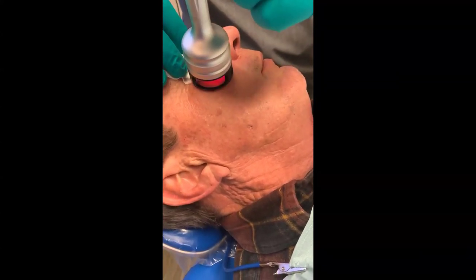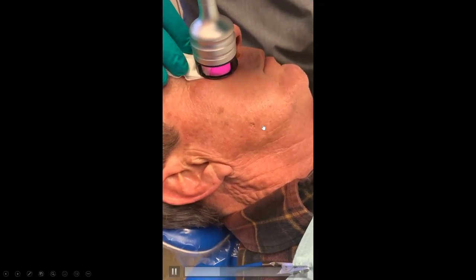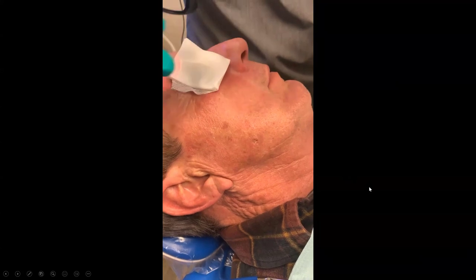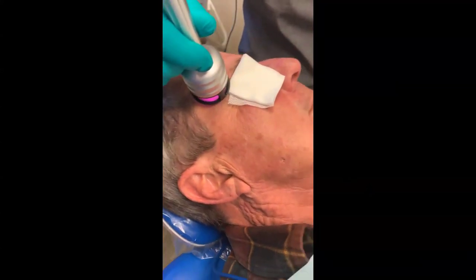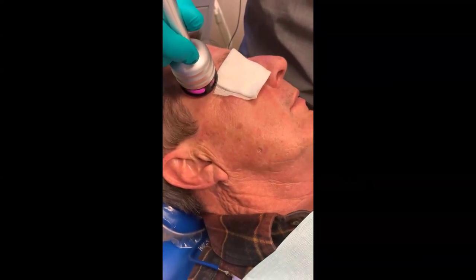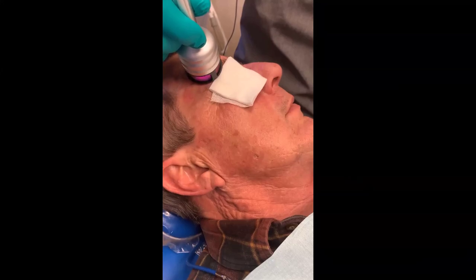But at one point, when we were up there, we saw his face twitch somewhere down here. This is the first appointment, and I knew I was able to help him. I got some excitation of the nerve. We move this around 6 to 8 minutes.